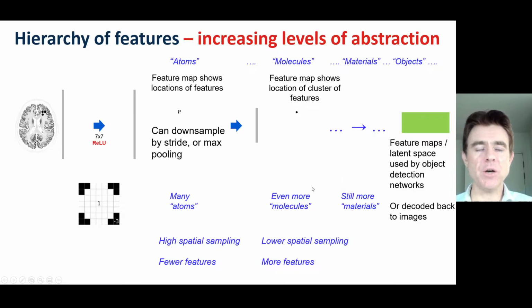And so what we end up with, if we keep going with this kind of processing, is what's called a feature map. In fact, all of these are feature maps, but here, the feature map at the end of this chain of processing often has very low spatial dimensions, but very high feature dimensions. And if you like, what we've done is capture the salient information in our input, and we've just represented it in a feature space, a latent space instead.